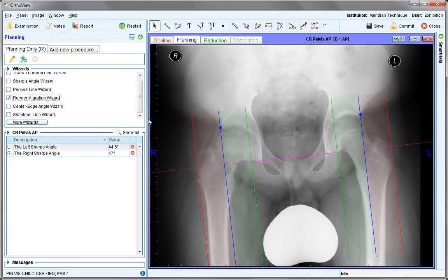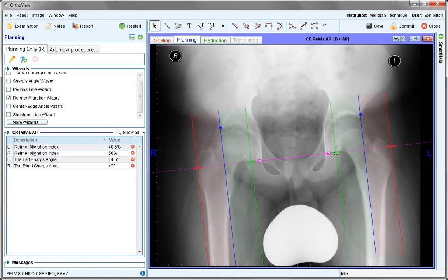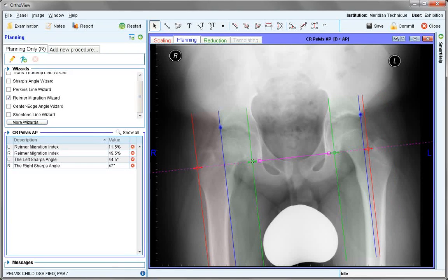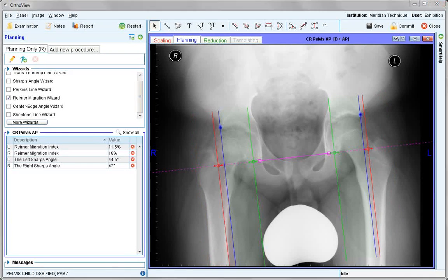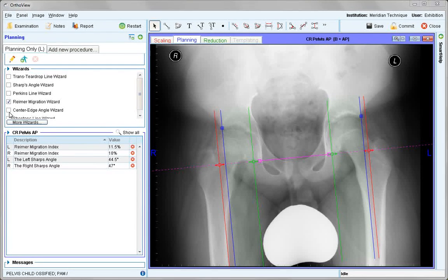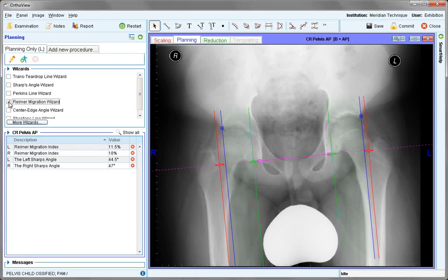The pink line sits on the trans teardrop line and the blue line sits on the lateral part of the acetabulum. The green and red lines are then positioned to cover the most medial and lateral parts of the femoral head on both sides. The Rhymer migration index recorded shows the percentage of the overall femoral head which is outside of the blue line.